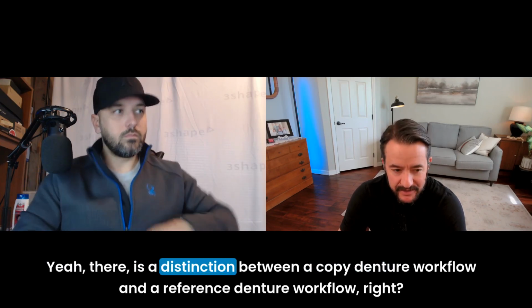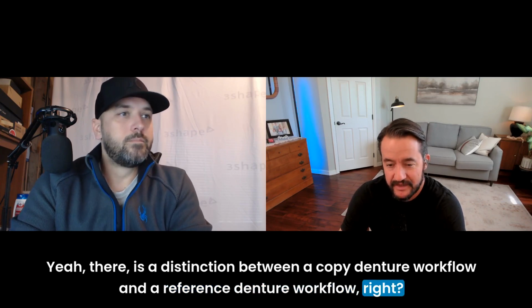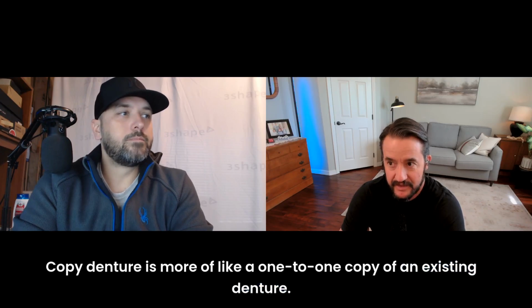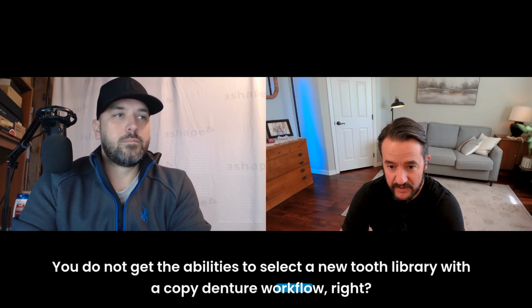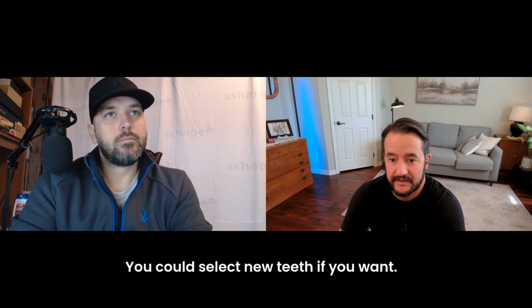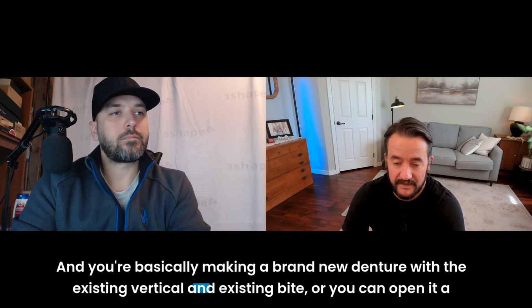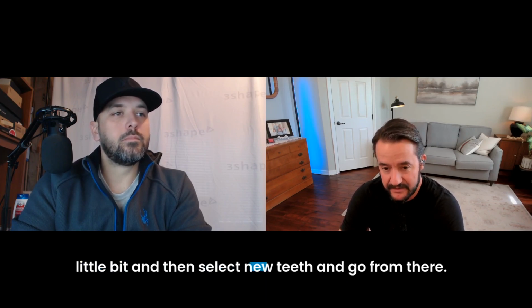Yeah, there is a distinction between a copy denture workflow and a reference denture workflow, right? Copy denture is more of a one-to-one copy of an existing denture. You do not get the ability to select a new tooth library with a copy denture workflow, right? Right. With a reference denture workflow, you're using the old denture like a custom tray. You could open the bite, you could select new teeth if you want, and you're basically making a brand new denture with the existing vertical and the existing bite, or you could open it a little bit and then select new teeth and go from there.